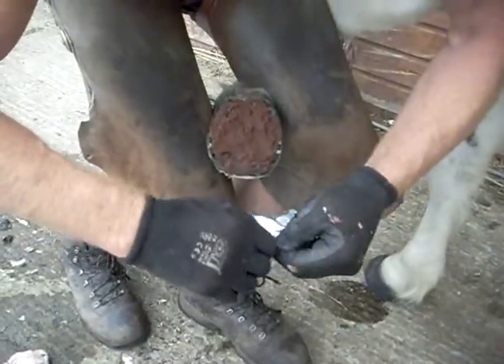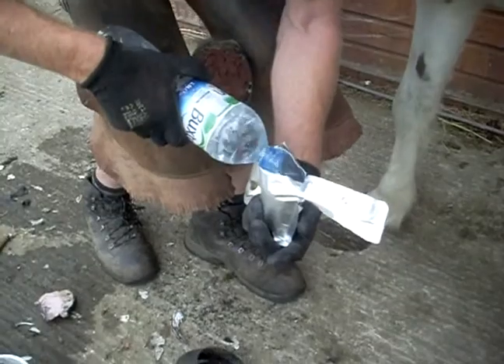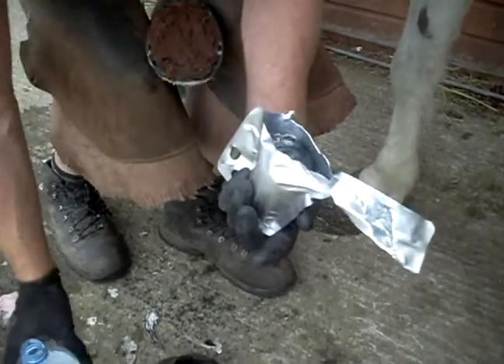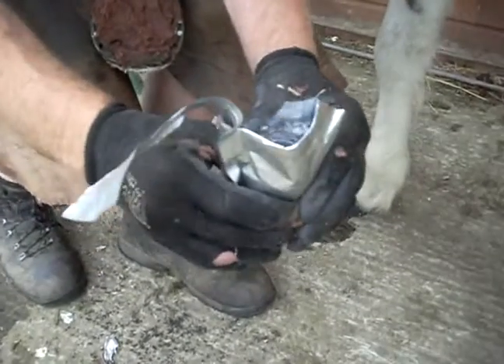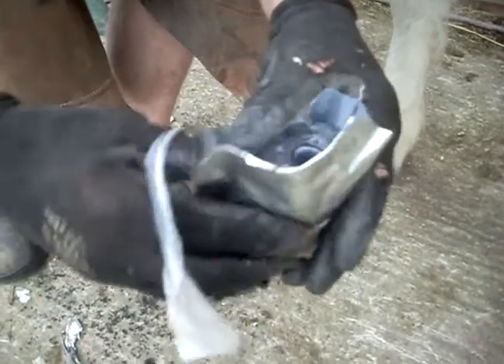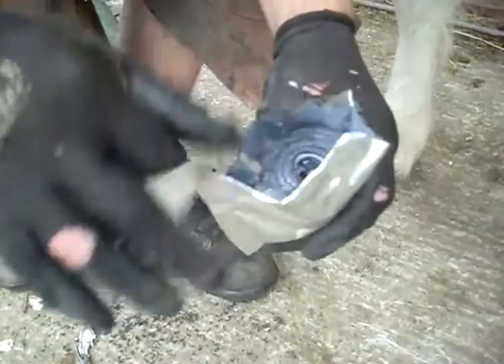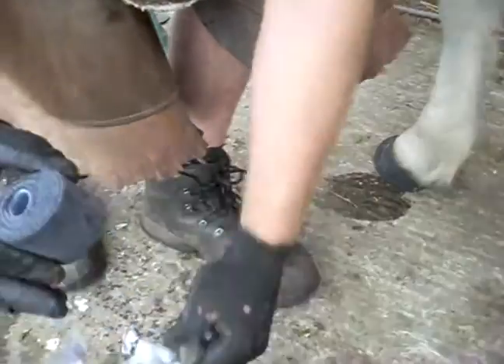I'll quickly just open the pouch and let that soak in for about 10 seconds. I'm just giving it a squeeze, a bit like a sponge, so that it soaks the water in. You only need about 10 seconds or so, and then we just pop that out.